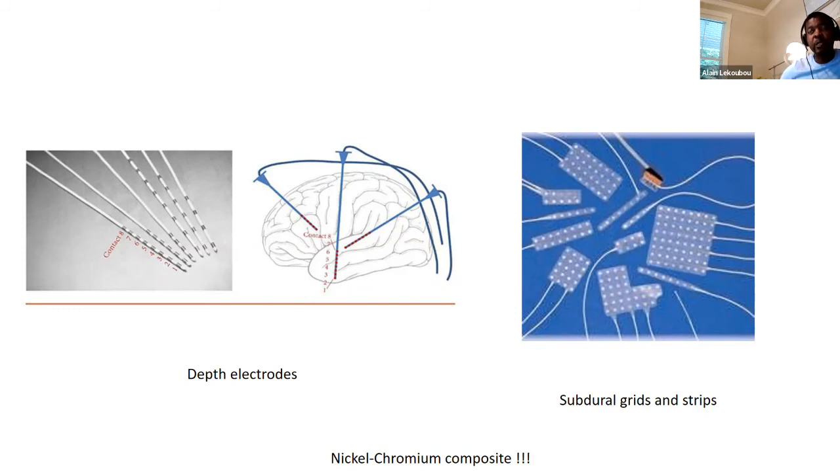In that instance, you want to go inside and do what we call a stereo EEG. You sneak your microphone in, get to the left temporal and then close to the right temporal lobe, and you can capture a seizure coming from this area. If after 3-5 days you captured 40 seizures that are all coming from the right side, then you can tell the surgeon that all those seizures are coming from the right side. The left side is just making noise, just background noise. I don't think it's something really important to worry about.